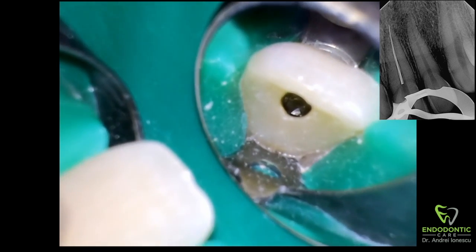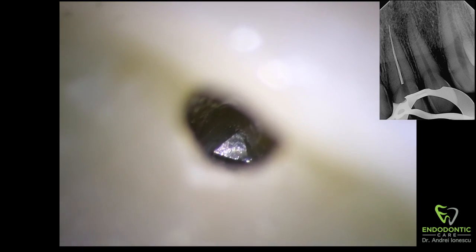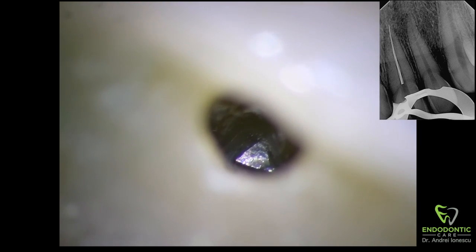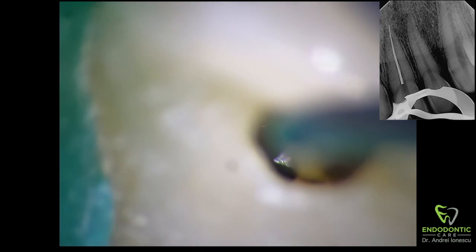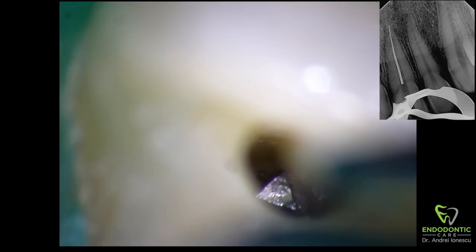In this case the access is quite good — you can see the file clearly and there's quite a bit of room. I chose the largest diameter, the 0.12 millimeter wire. The file is triangular in cross-section, and like I said, it was about 15 millimeters down from the incisal edge — just a little bit too far down to grab with other systems we had.